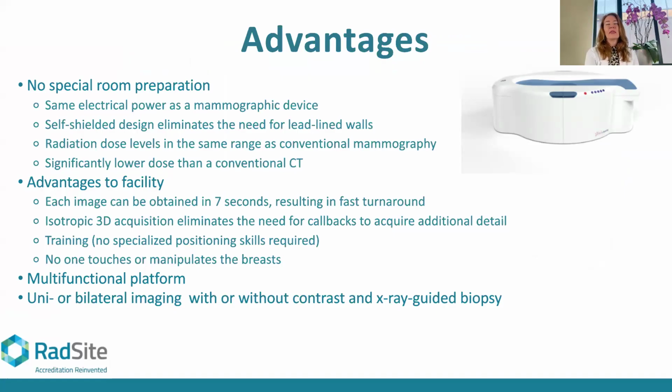But one of the things I love about this imaging potential is when I do really lean into the contrasted studies. So for me, for our practice here in Los Angeles, we're an urban practice that skews very young. A lot of our patients are very young. A lot of our patients fit in those high risk categories. They have extremely dense breasts. They're showing high risk scores, high computed risk scores. These are a very educated patient population that really knows a lot about their family history and their personal history. They're aware that if they have an elevated risk score, that they need additional advanced imaging and contrast-based imaging.